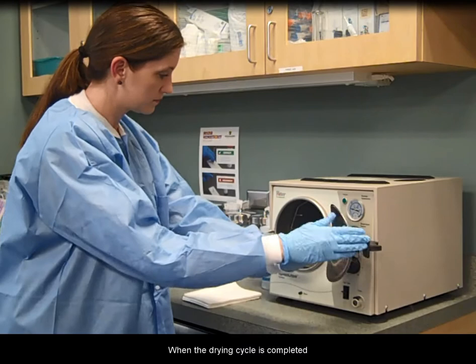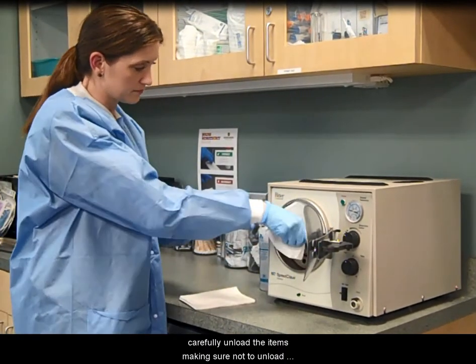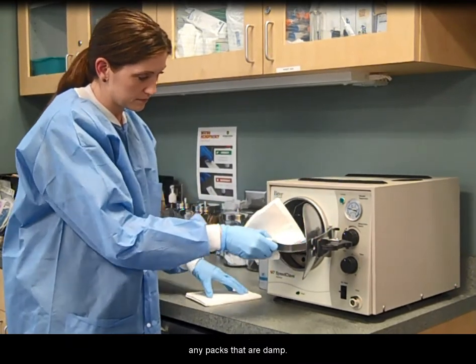When the drying cycle is completed, carefully unload the items, making sure not to unload any packs that are damp.